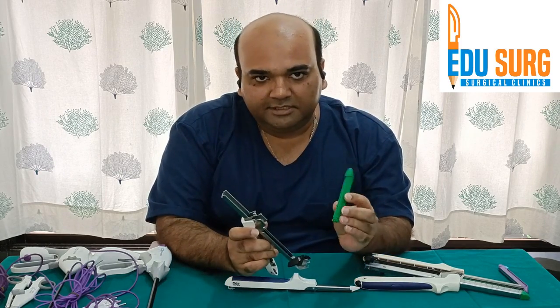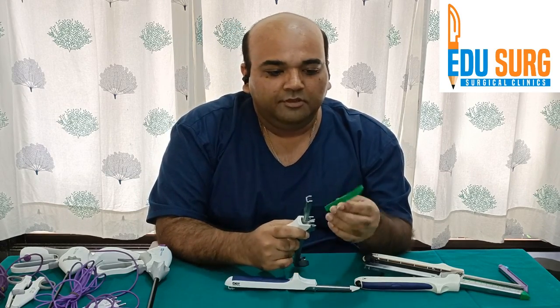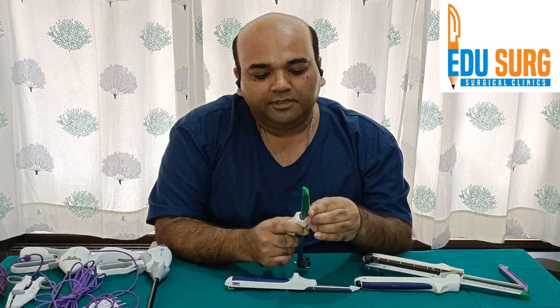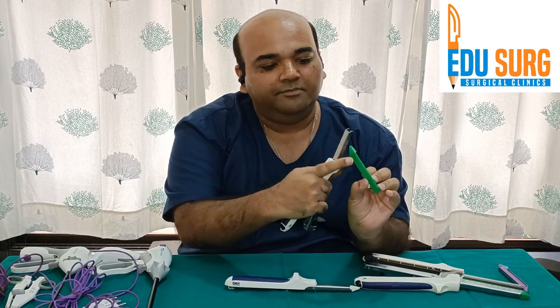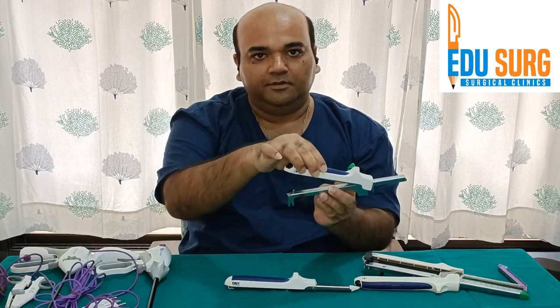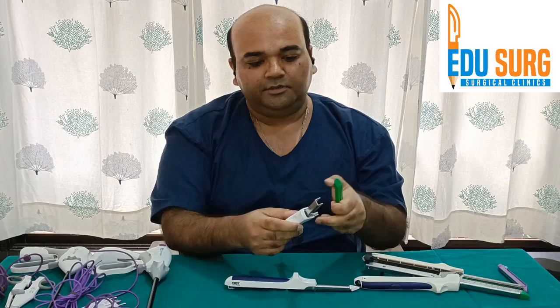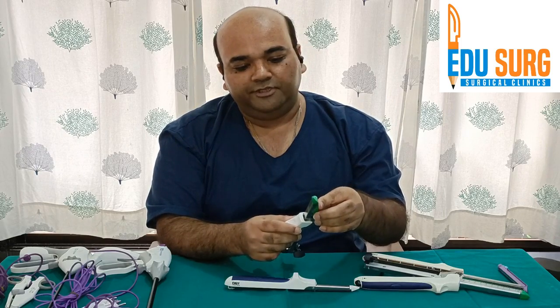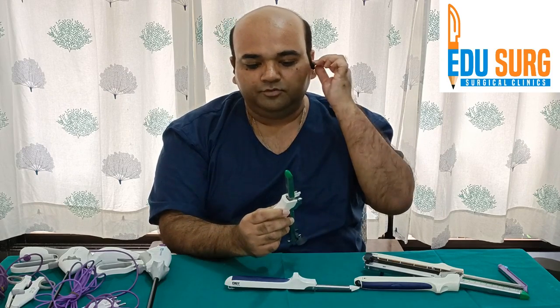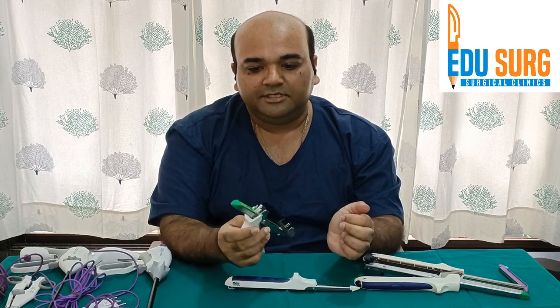Now we will see how to load the stapler. This is an open cartridge just to demonstrate. What you do is, once you have opened the cartridge, you fix the nozzle first. There is a locking mechanism in this nozzle. You fix this nozzle first and you have to keep this open until you are fixing the stapler to the bowel. Then you fix the stapler here and press it — once you press the stapler here it is fixed.